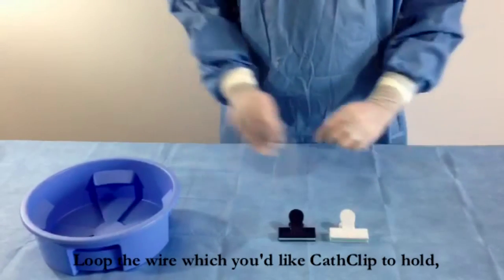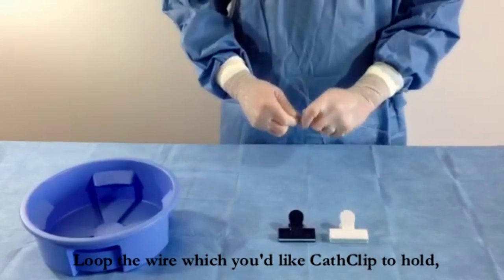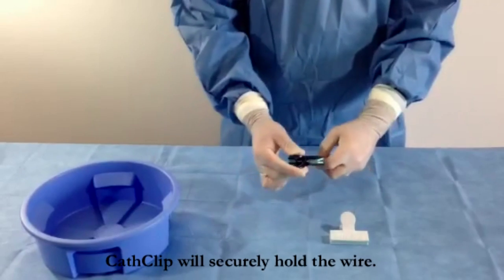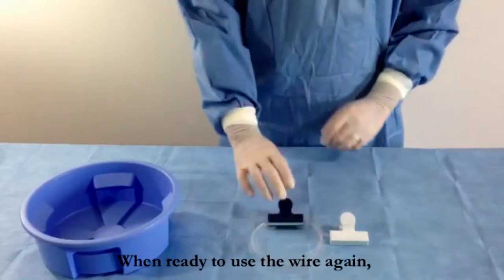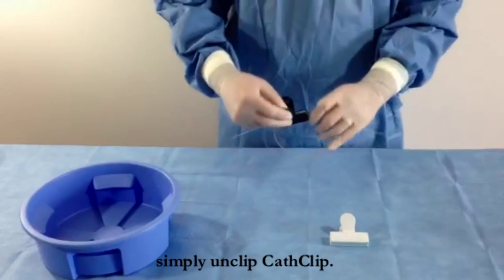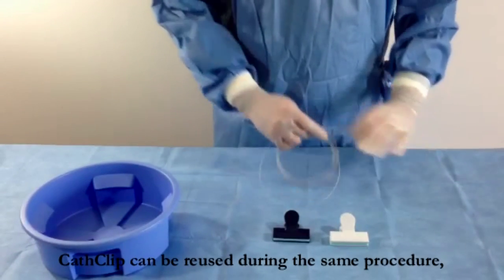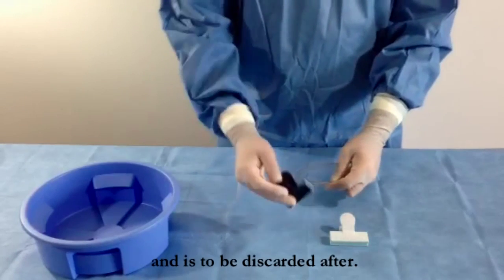Here we demonstrate with a guide wire. Loop the wire which you'd like CathClip to hold, and simply clip CathClip on the looped wire. CathClip will securely hold the wire. When ready to use the wire again, simply unclip CathClip. The wire is now ready for reuse. CathClip can be reused during the same procedure and is to be discarded after.